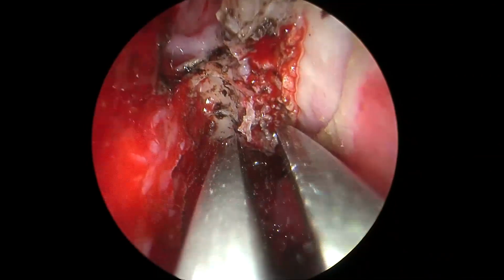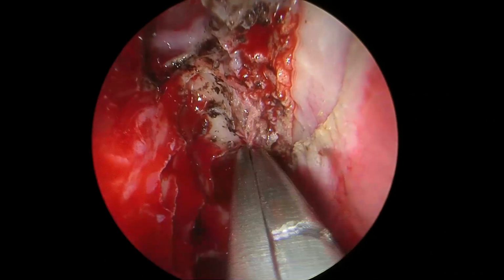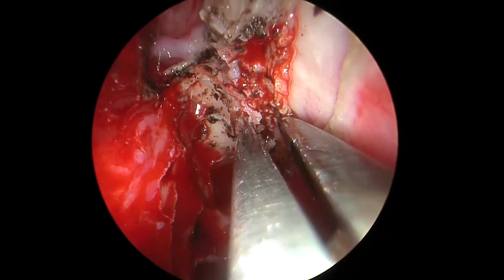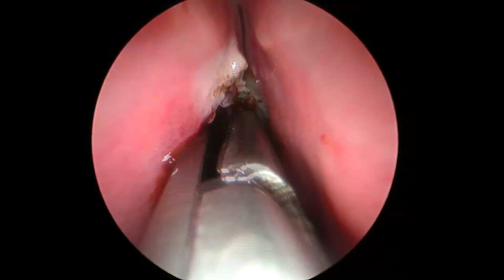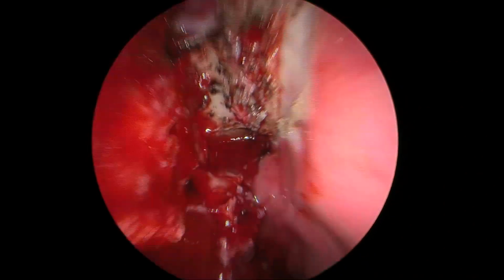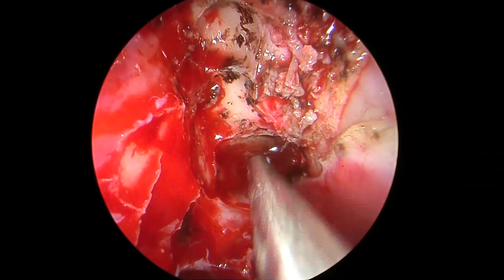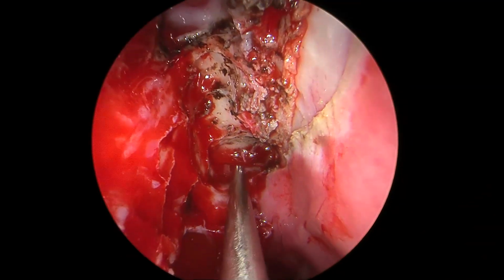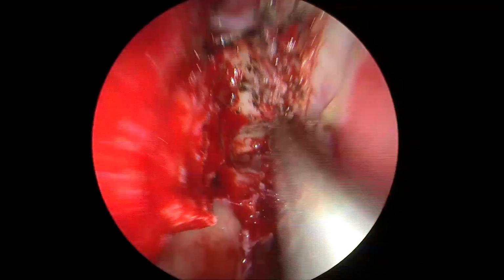Hemostasis is very important, as you see here. Once we have ablated, we have to remove any bone chips or excess mucosa, any excess loose-lying bone. We don't want to push bone deep inside the cranial cavity. So this has to be cleaned minutely. Now you see, for the most part, we are doing well here. A lot of bone is now exposed.